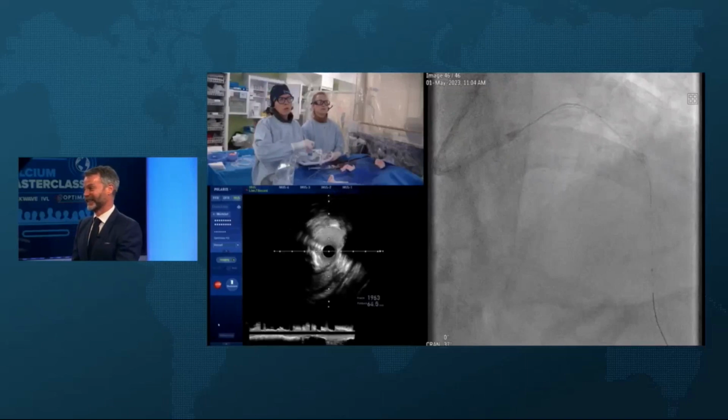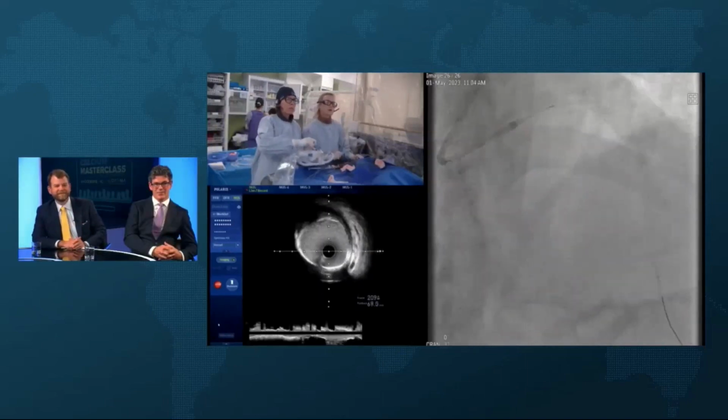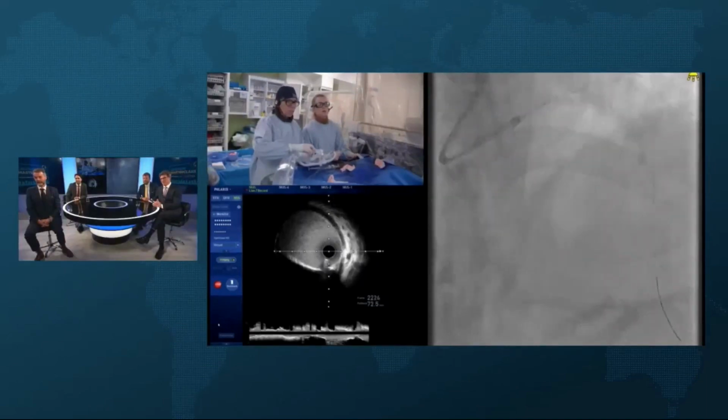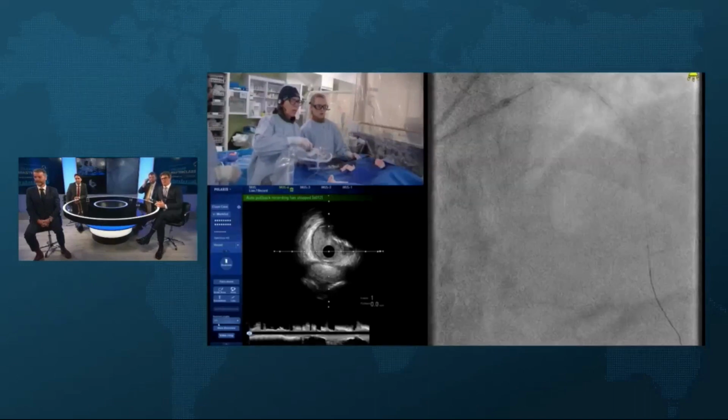No, that's exactly it. I got a stent in, so we're fine. We've modified the ostium nicely. I think it's all nicely modified. Oh, that's actually good. You've got a landing zone as well, which is ideal.